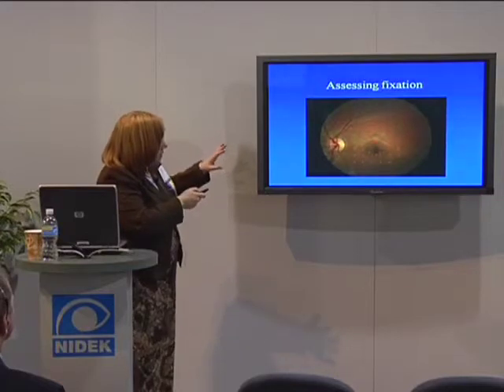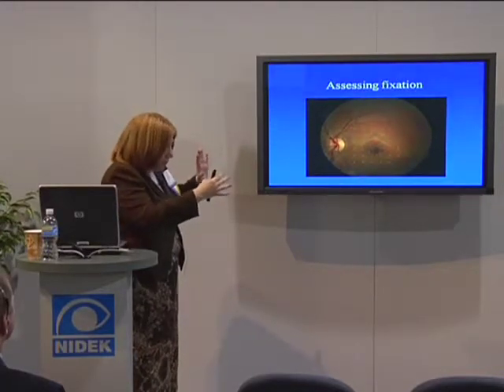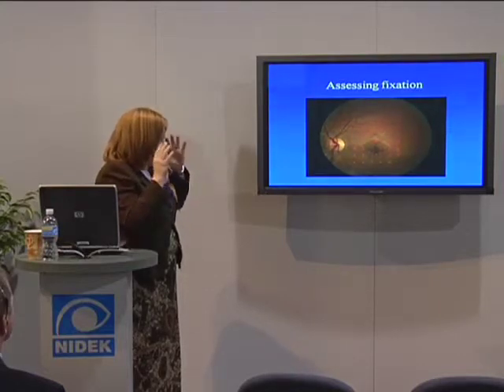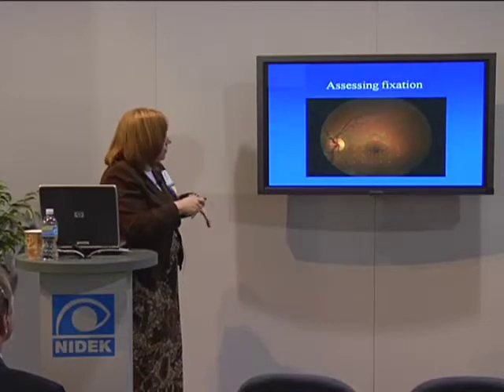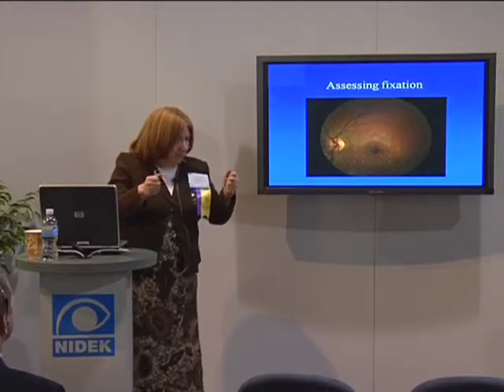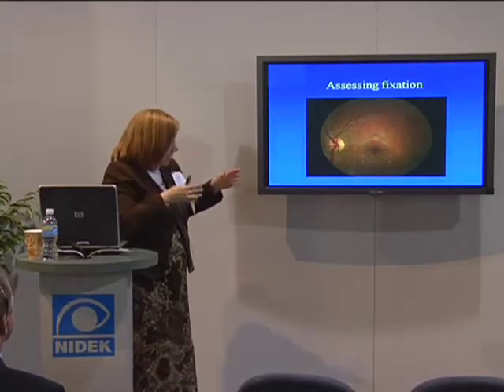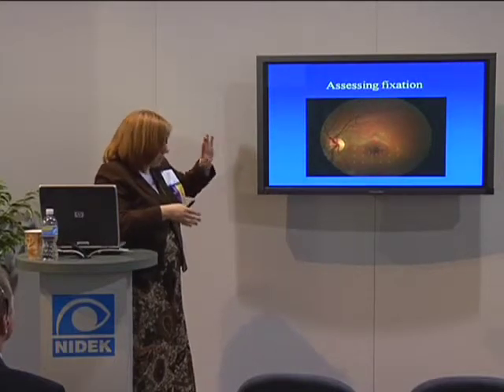On a fundus photograph, we all know that normally things are reversed. Right is left and left is right in terms of how it goes into the brain and how it maps to the surroundings, to your visual field. But since when we take a fundus photograph, we're basically facing the person, we've already turned them around, so to speak, right to left. So right and left on a fundus photograph is the same as it is in visual field space, as the patient's sitting. But up and down is the reverse.